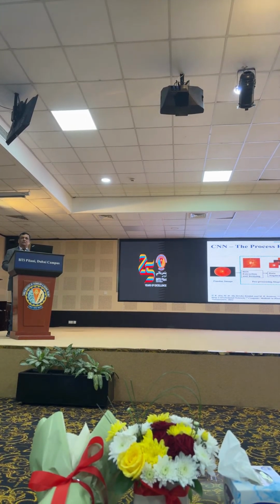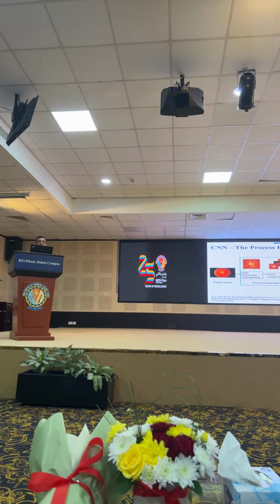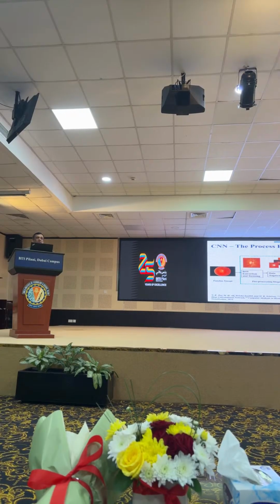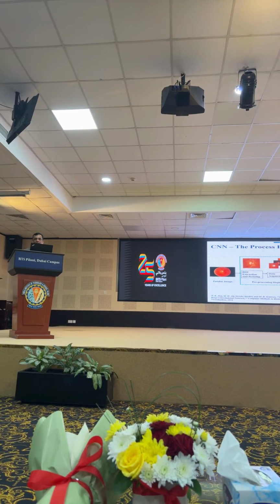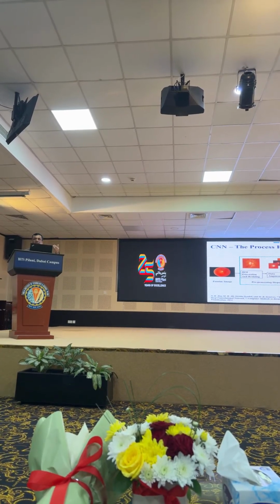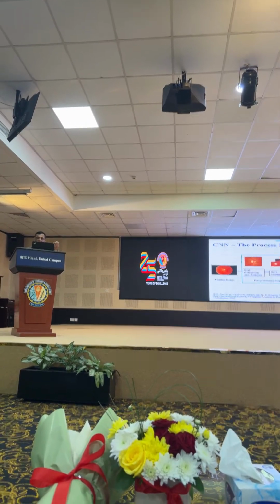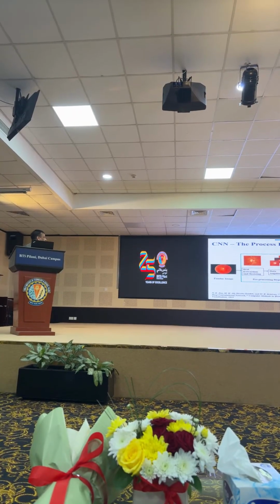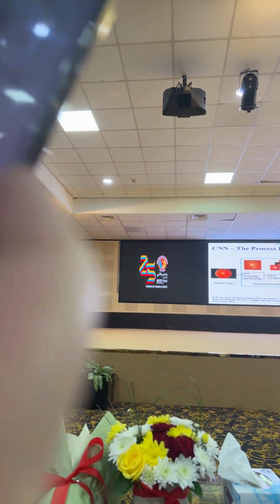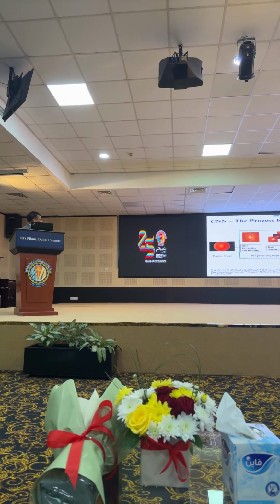So the process, most of you who are working know. We start with the fundus image, and you extract the region of interest. In the case of glaucoma, the region of interest is your optic disc. When the optic nerve fiber layer, which is behind the retina, starts getting affected by glaucoma, that is reflected in the way the cup and disc typically get affected. As I said, a high cup to disc ratio is one feature that characterizes glaucoma.